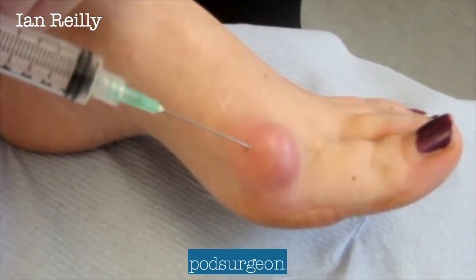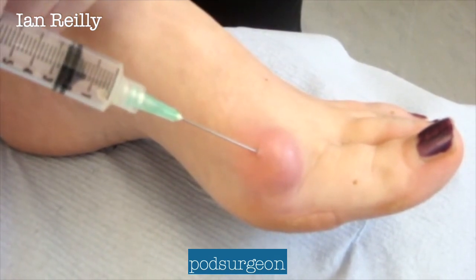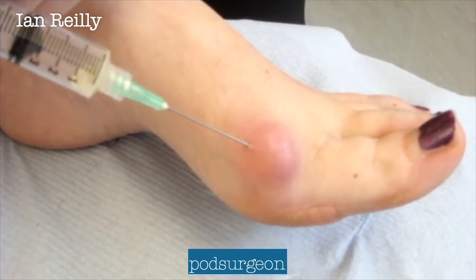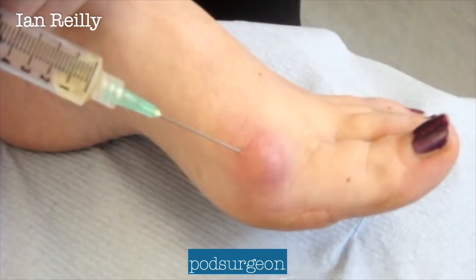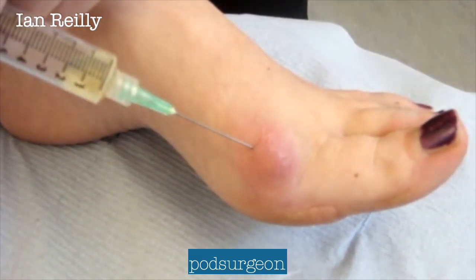Here's a short video of a ganglion aspiration done in clinic recently. We're using a 10ml Luer-lock syringe with a green 21-gauge needle. Ideally we would use a bigger 20ml syringe, which gives a little bit extra pullback, and ideally a 19-gauge or white needle, just to make the lumen of the needle as wide as possible.